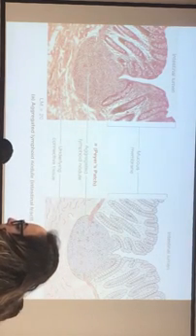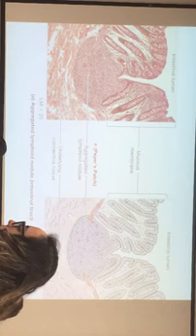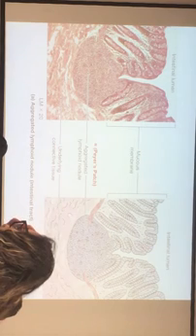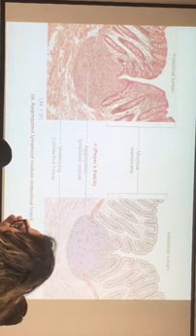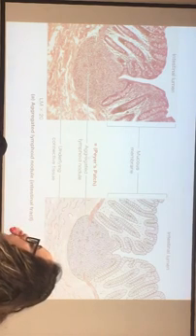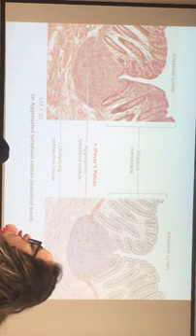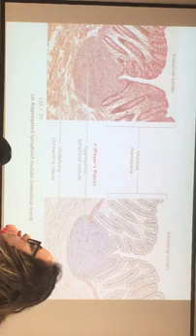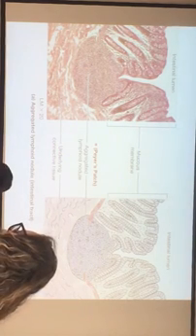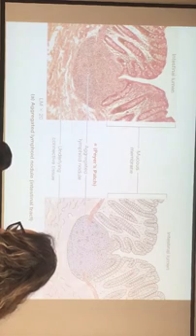This one, from I think it's the small intestine, and I'll show you this part here. The ideal figure looks like this. We call it aggregated lymphoid nodule, or Peyer's patch. And what's the function? It can send out cytotoxic T lymphocytes. If there is a virus or any pathogen in the food in the lumen area, it can attack it.